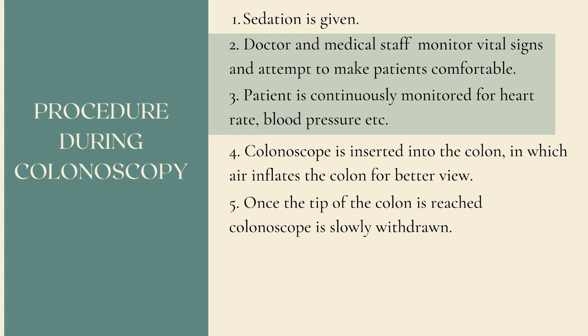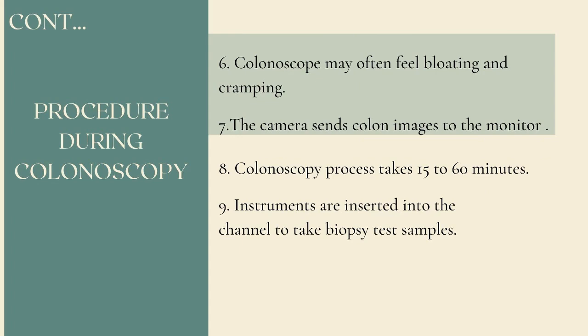Once the tip of the colon or the last portion of the small intestine is reached, the colonoscope is slowly withdrawn and the lining of the colon is carefully examined. The colonoscope may often make you feel bloating and cramping in the abdomen or the urge to have a bowel movement, but with the medication, pain is controlled, it infrequently causes severe pain, and it is tolerated. The camera sends images to an external monitor so that the doctor can study the inside of your colon. The colonoscopy usually takes 15 to 60 minutes.